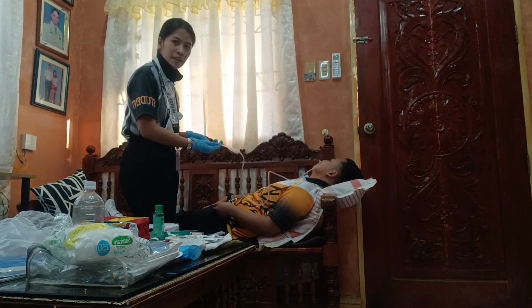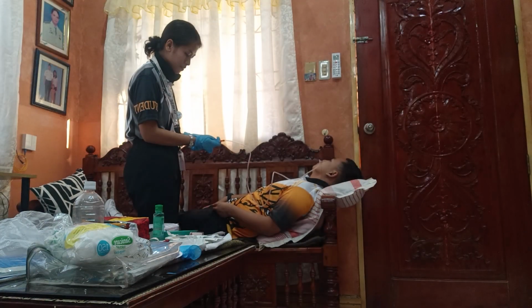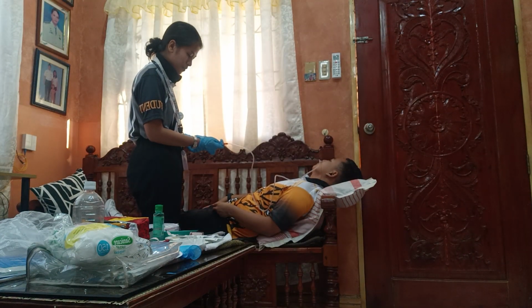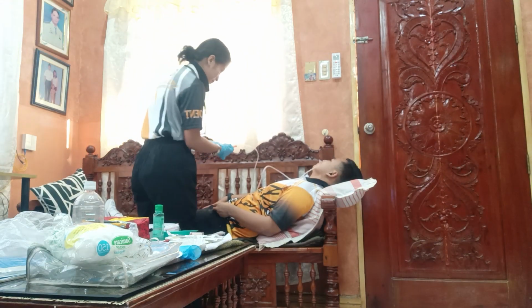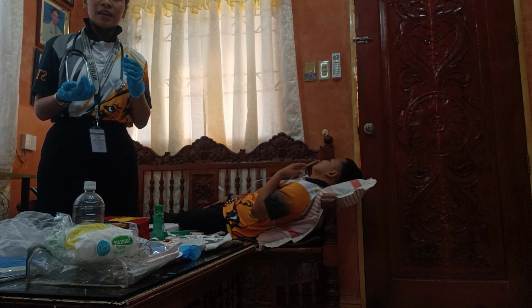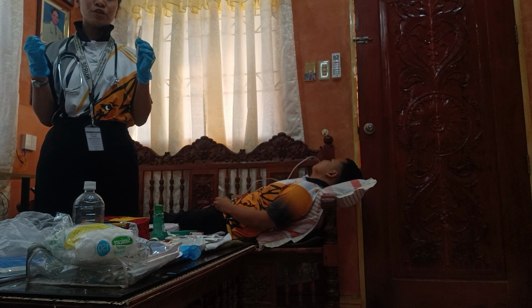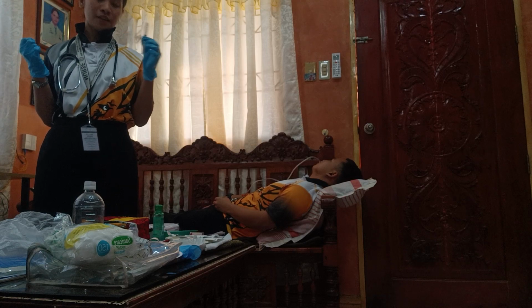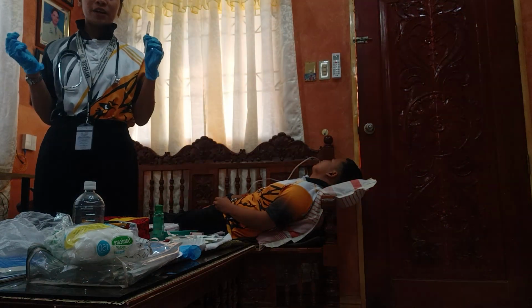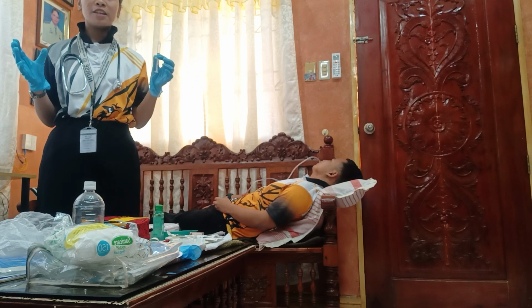Ito po, mag-a-aspirate po tayo. After po na ma-aspirate is, i-measure po yung na-aspirate in pH paper. Yun po, gamit po yung pH paper.